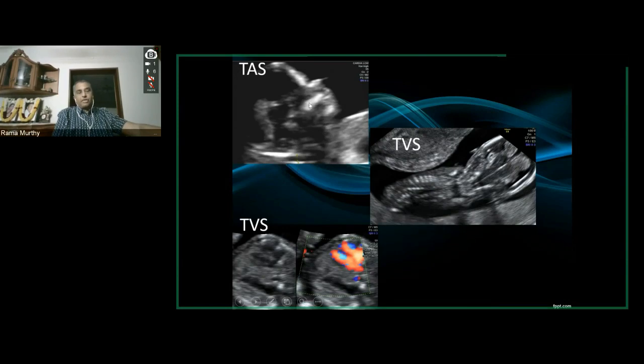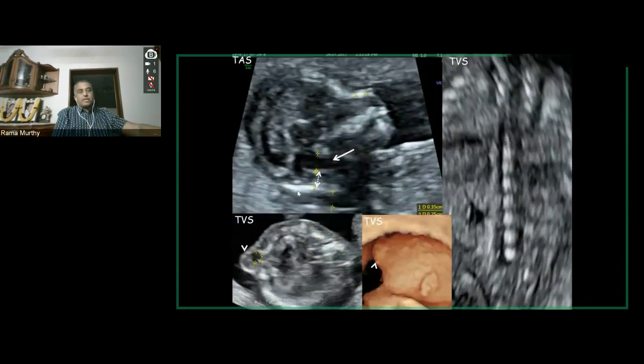Again, another example, altered posterior cranial fossa findings on mid-sagittal section, and of course a huge spina bifida over there. That's a diaphragmatic hernia that you see in the same case. Now let's look at this case. Here is a transabdominal ultrasound, and from a mile away we know that this is abnormal. The normal structure is gone. You don't have the two white lines and the three bands happening there.